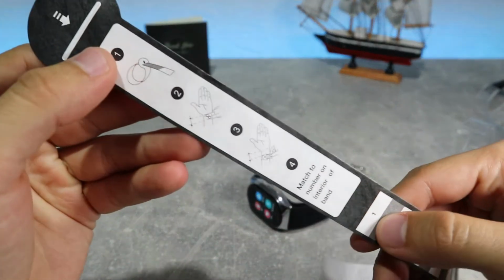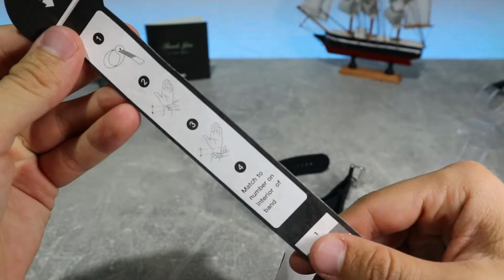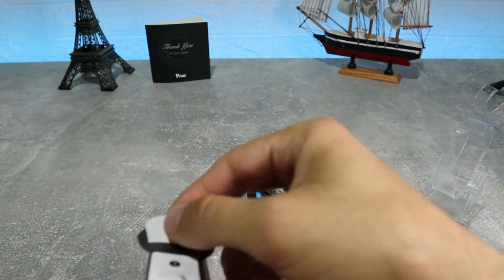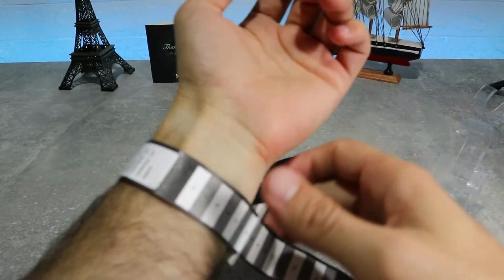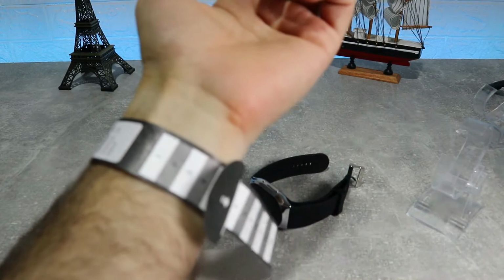The first step before using the BP Doctor Pro smartwatch for blood pressure measurement is to use the measurement tape by placing it around your arm, 2 fingers away from the base of your palm. To check the hole you should use on the wristband. In my case, I had to select the 7th hole.